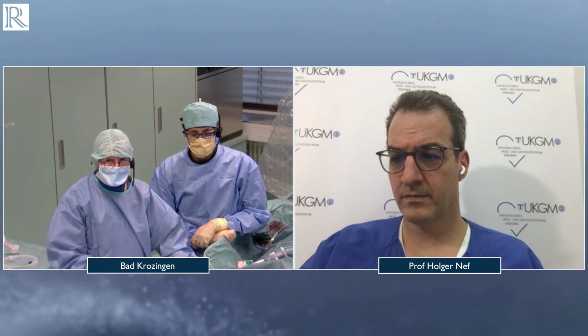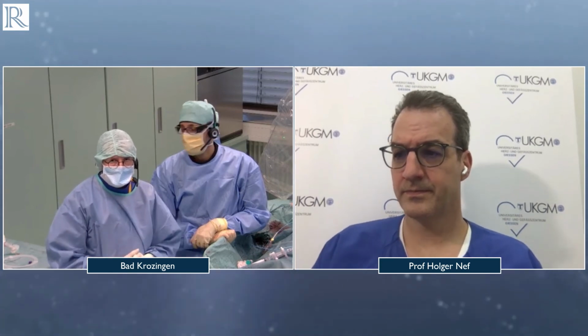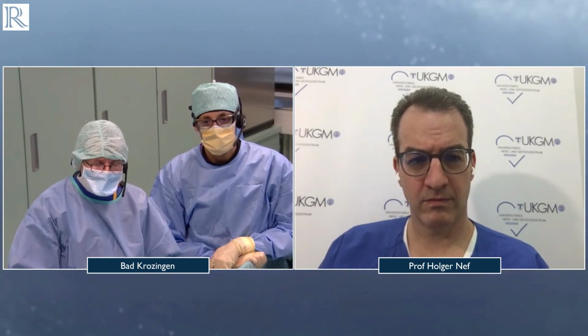So for that reason, either you go with a 2.0 non-compliant balloon, maybe up to 8 to 10 atmospheres, not to risk dissection. And if this doesn't work, it doesn't make sense to risk the crossing with the IVL balloon, because on the other hand it's very delicate.